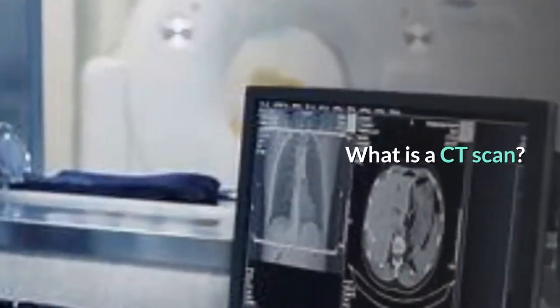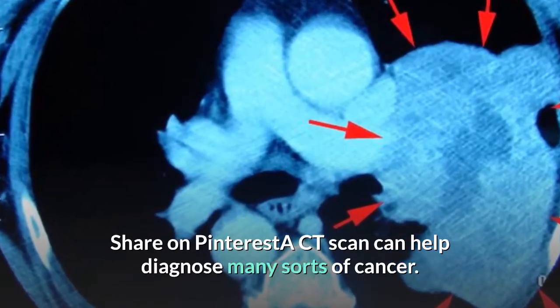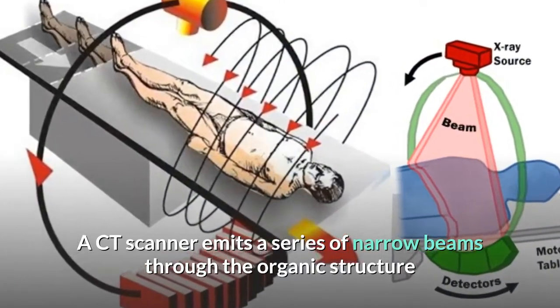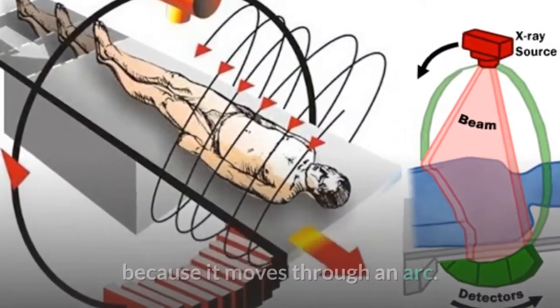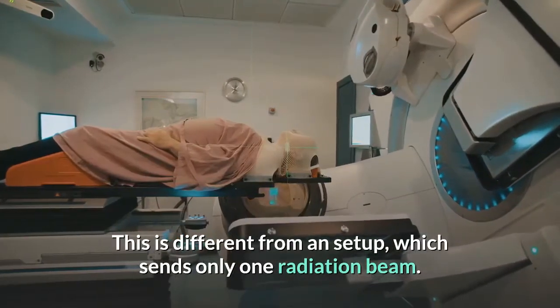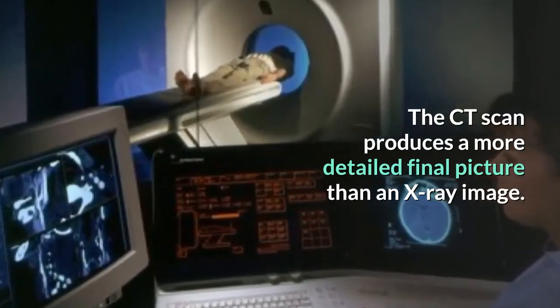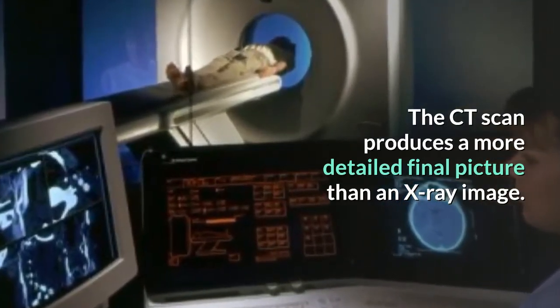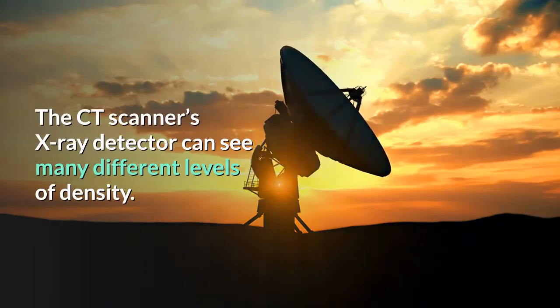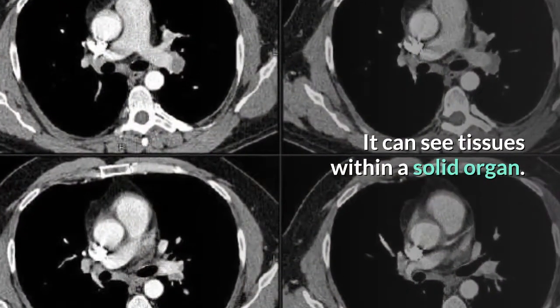What is a CT scan? A CT scan can help diagnose many sorts of cancer. A CT scanner emits a series of narrow beams through the body as it moves through an arc. This is different from an X-ray setup, which sends only one radiation beam. The CT scan produces a more detailed final picture than an X-ray image. The CT scanner's X-ray detector can see many different levels of density. It can see tissues within a solid organ.